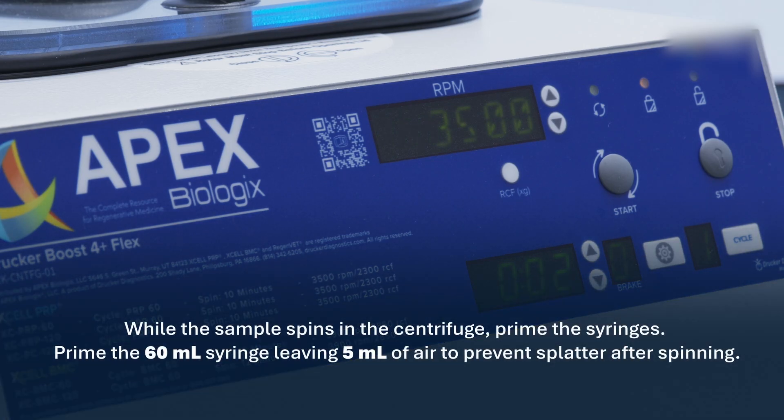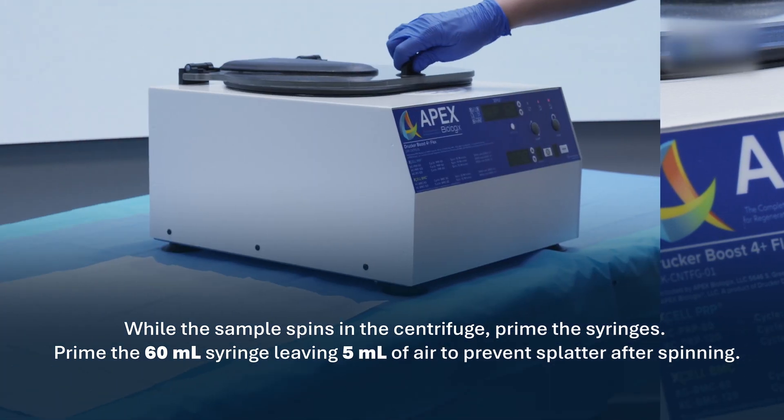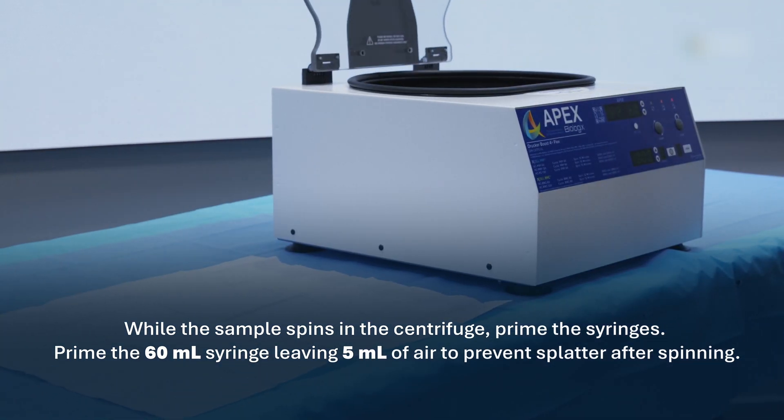While the sample spins in the centrifuge, prime the syringes. Prime the 60 milliliter syringe leaving 5 milliliters of air to prevent splatter after spinning.